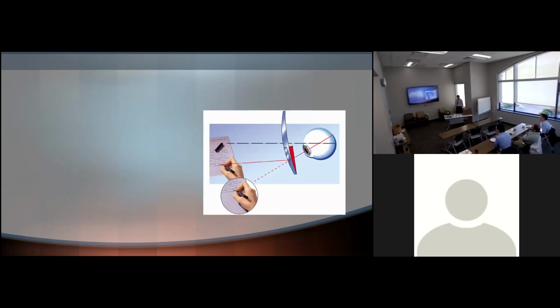This is an interesting concept that's only applied in this situation, called slab off prism, in which the optician can grind the bottom segment of the lens to eliminate the prismatic effect of the lower segment of the glasses. So there is slab off and there is reverse slab off. There are very specific terms applied here.